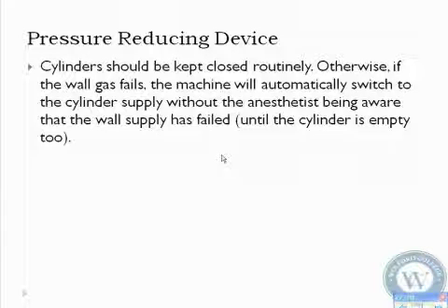You usually only need seconds to switch over from the regular house supply to emergency power. And emergency power always has to come on. I think the rule is within 5 seconds. Emergency power must come on. So you're not talking about any real length of time.